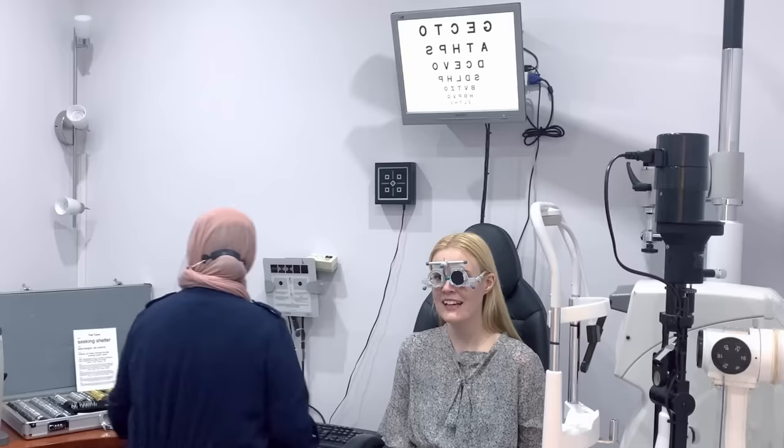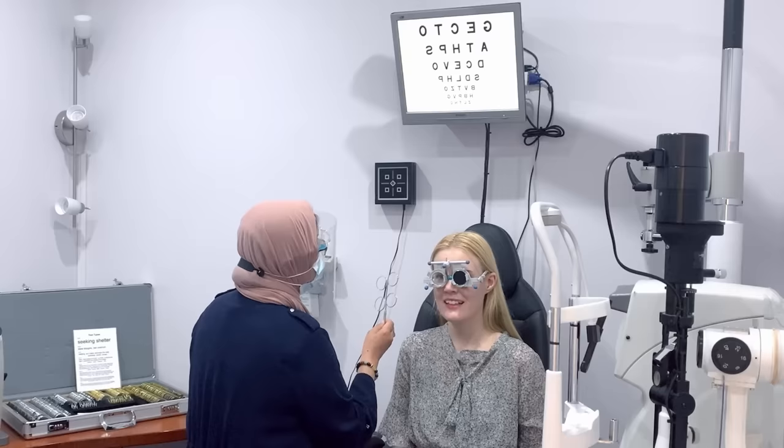Yeah. So again, I'm just going to pop the lens up. And you can still see that there, can you? Yeah. Okay. And can you still see it here, or is that worse? It's slightly worse. Better without it, yeah? Yeah. Okay, good. That's excellent.